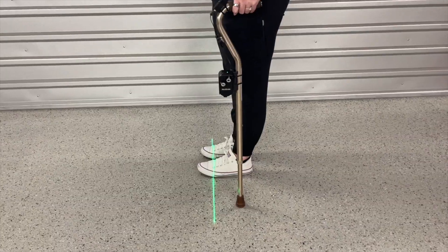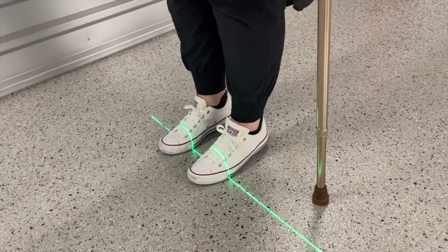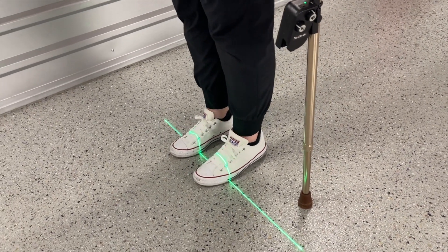To further practice the ankle strategy, turn your Nextstride device so that it projects the horizontal line. Step onto the line and try to bring the laser from the front of the foot to the back.